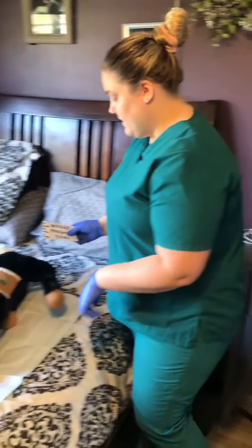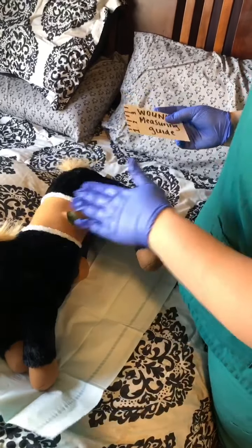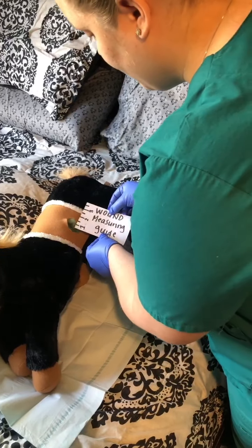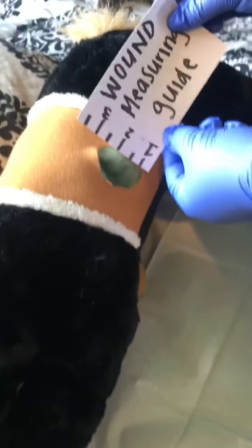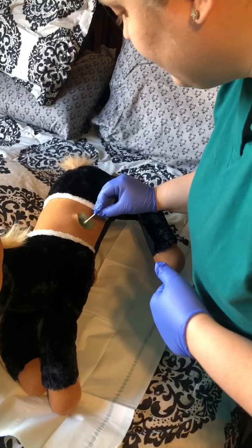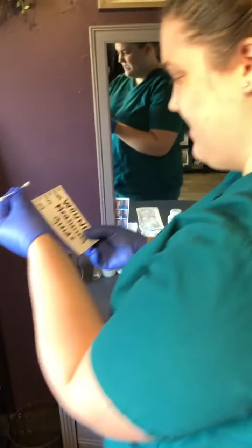So I have my pad underneath, so I'm going to measure the length, width, and depth of the wound. So length will be from head to toe, and I'm going to be careful not to touch the skin with it. So that's about 2 centimeters in length, and then width, about 2.5 centimeters. And then I'm going to take my sterile, or my cotton tip applicator, and I'm just going to put that in right before the skin, making sure that I don't touch. Okay. And I'm just going to measure that. And then that's about 2 centimeters as well.